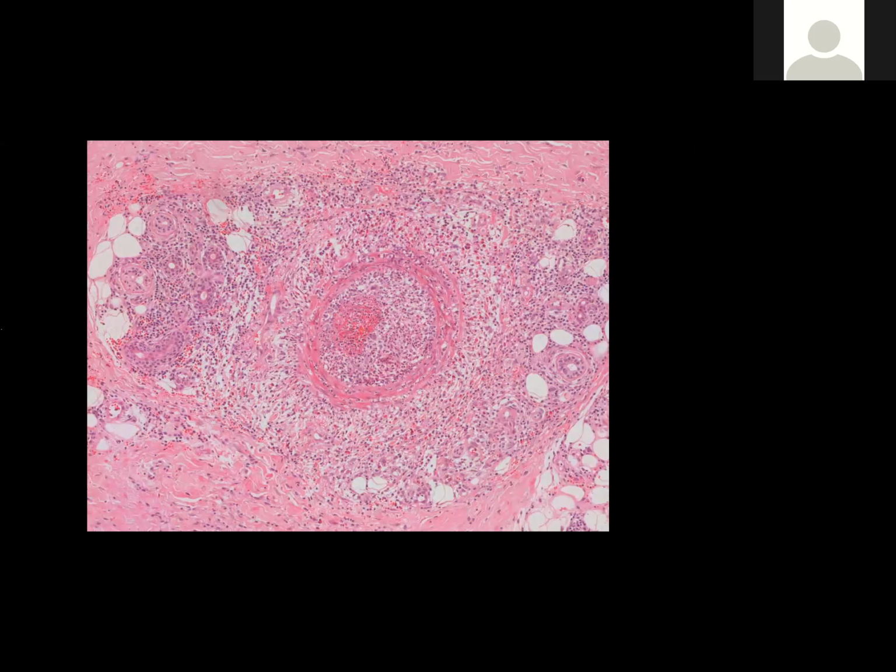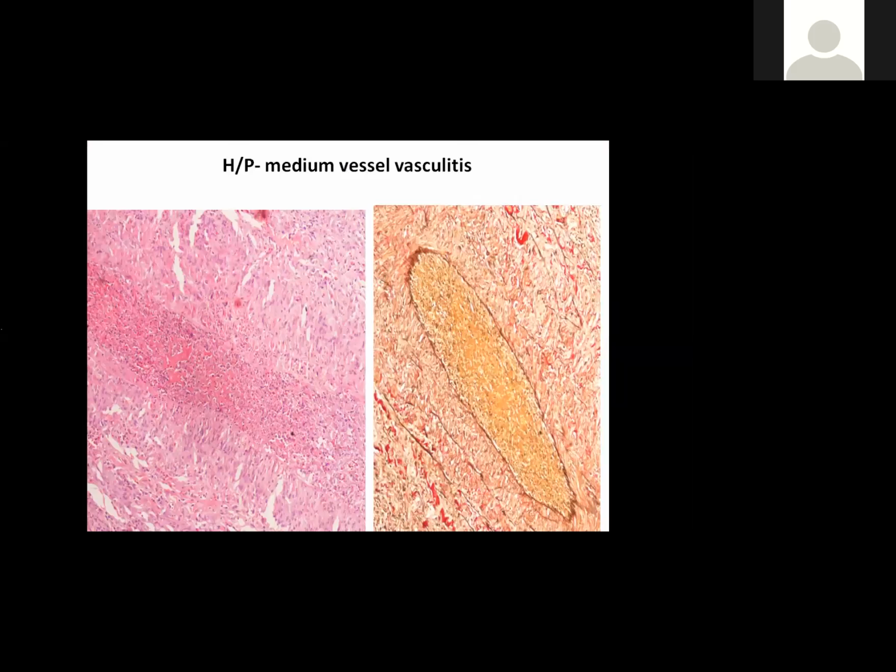So theoretically, this is okay. We can see classic erythema nodosum, induratum, and medium vessel vasculitis, and we can appreciate their histopathology, which is very, very classic. But unfortunately, at all times, these classic features or this manifestation does not occur in real life scenarios.